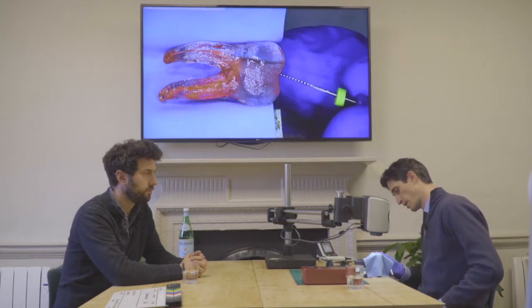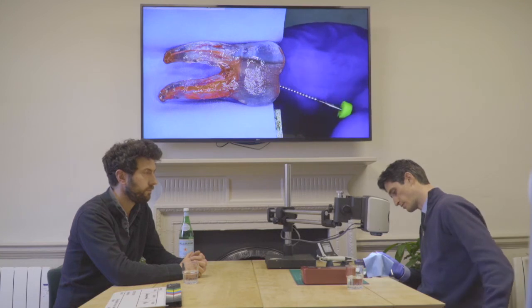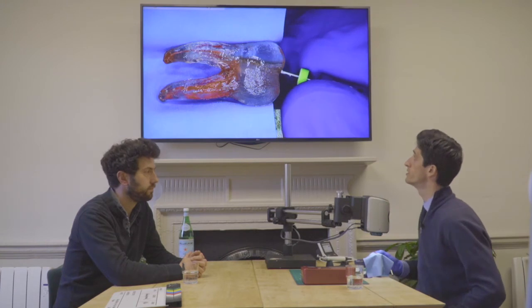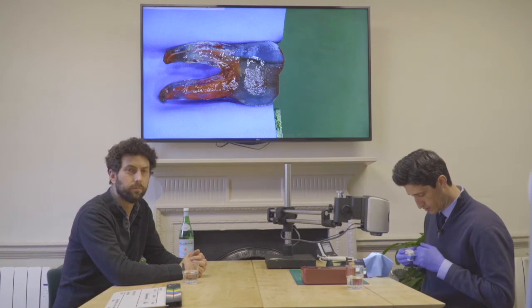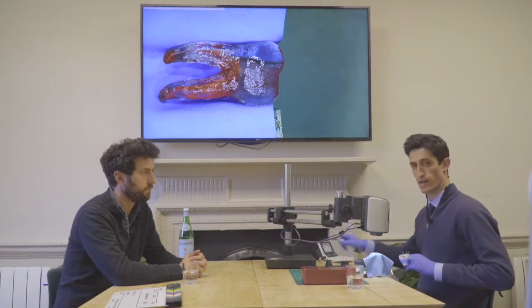I go back in with my size 10 to see whether there's any advancement. It's working hard there — my measurement was at 22. Now I need to secure that glide path.